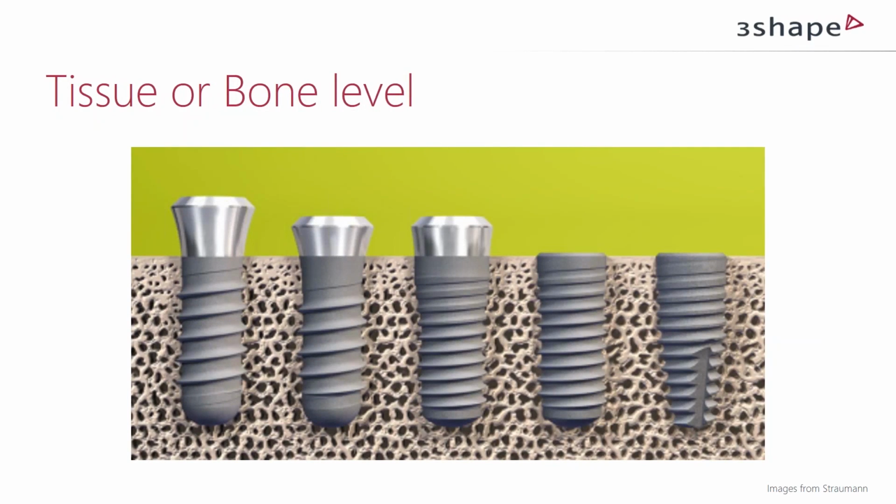So I guess it's interesting that there's multiple ways to obtain stability with different shaped implants. I mean, we've learned that now the overall surface area of the implant is important, the thread is important, the cut is important, and this all plays into how stable the implant will be placed.